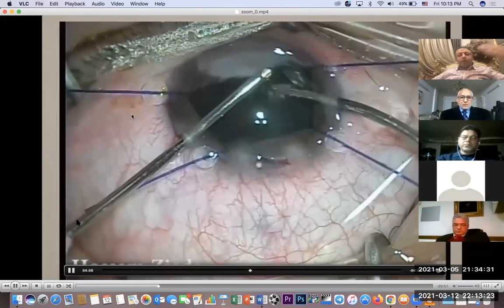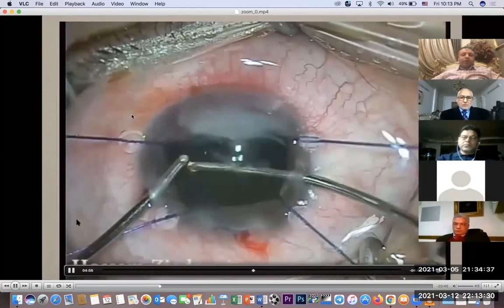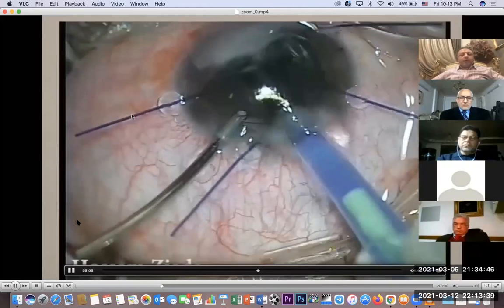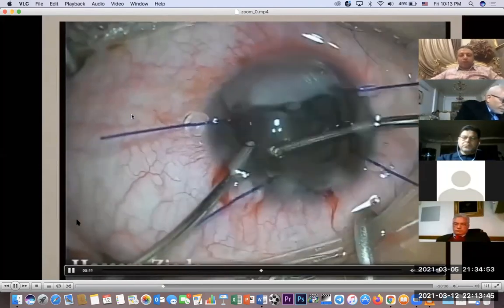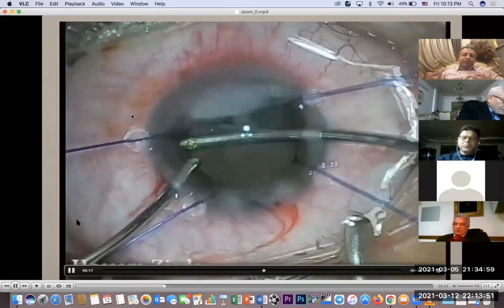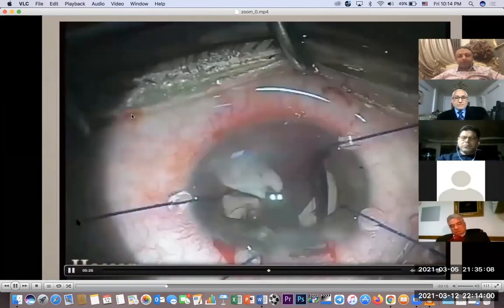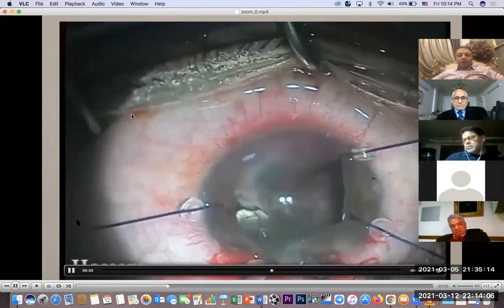I was worried about stretching of the anterior capsule because the visualization was so difficult and so hazy. But I'm trying all the time to preserve the bag to put the IOL. I injected the foldable IOL underwater as I used to do in all my cases. Under any situation, I can implant it underwater, except in the case of vitreous prolapse. But fortunately, I didn't get any vitreous prolapse. The bag was intact and the zonules were completely normal all around.